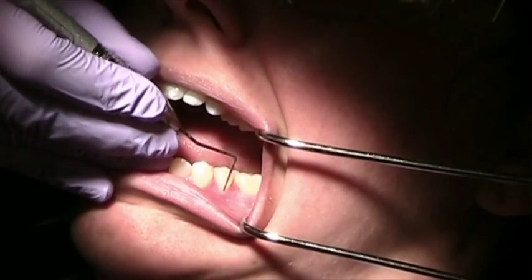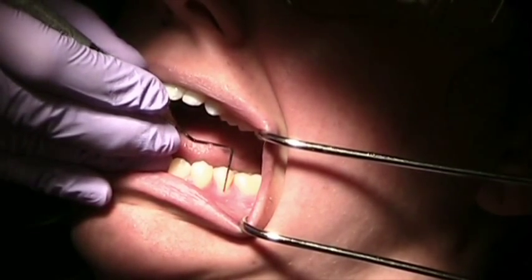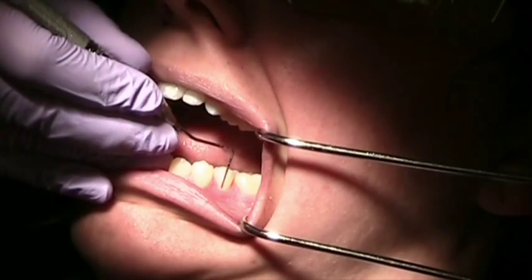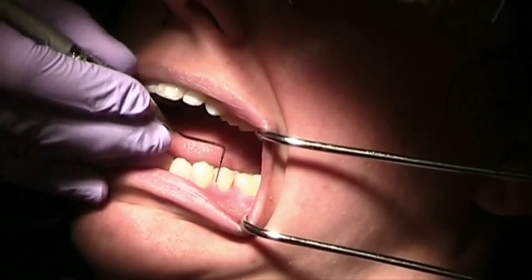On tooth number 20, the gingival margin is level with the CEJ, so no math is necessary. The clinical attachment level is the same as the probing depth. So in this case, the clinical attachment level is 2-1-2.